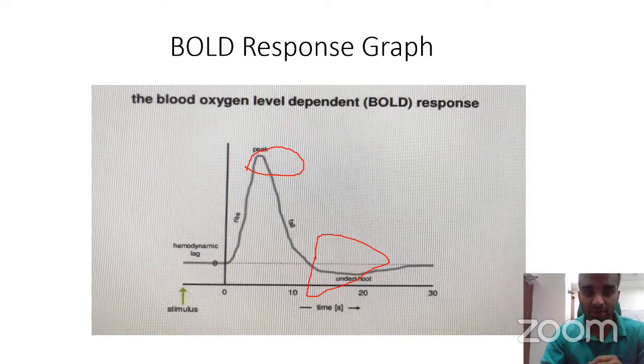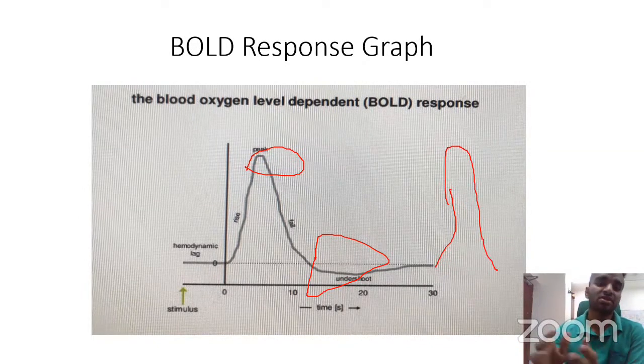After a certain period, when we ask the patient to start the activity again, flow to that region increases, and it comes up again. Then the patient relaxes after certain dynamic scans. And when the scan gets over, the system takes the average of all these peaks, and after processing, ultimately we get the activation which you have seen in yellowish color in the previous slide.